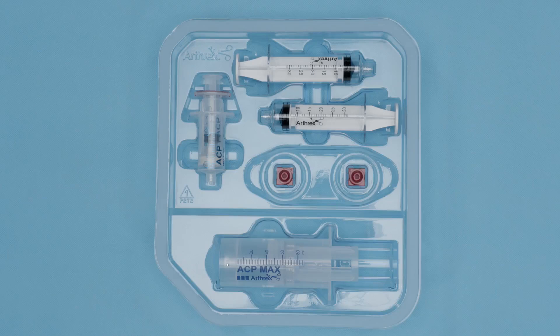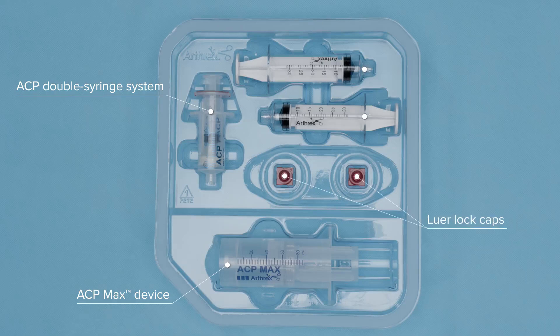Your ACP Max inner tray contains the ACP Max device, the double barrel ACP syringes, two lure lock caps, and two 30 cc syringes.